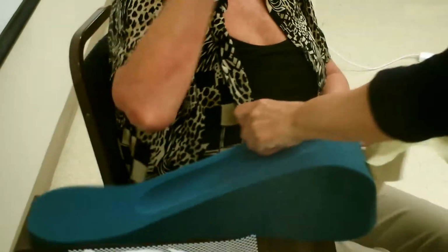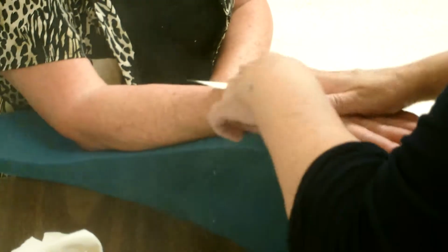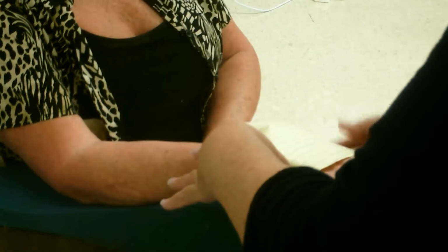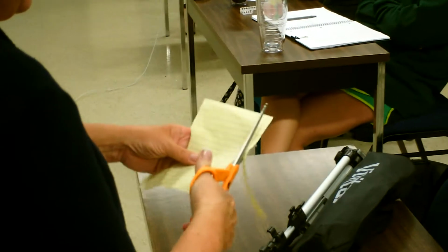So then I try it on the patient, and typically, I'm gonna go like this. My water's running out. Okay? And I say, is this gonna work on my patient? Well, that looks like it's gonna work. Okay? It might be a little wide actually on her. So I might even trim a little bit of it. Don't trim too much because otherwise you'll have not enough material.